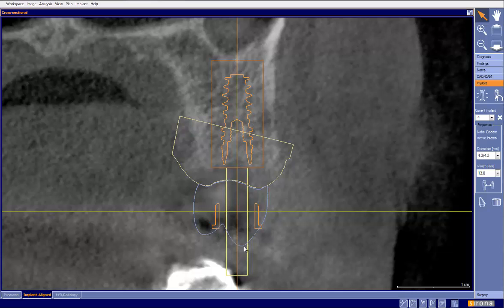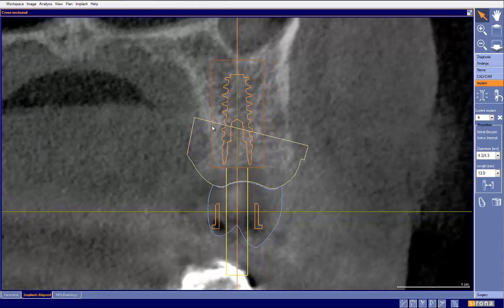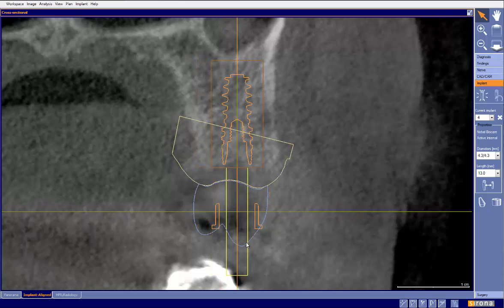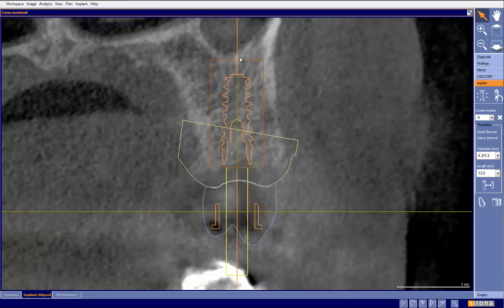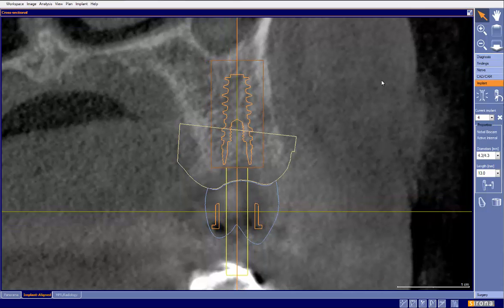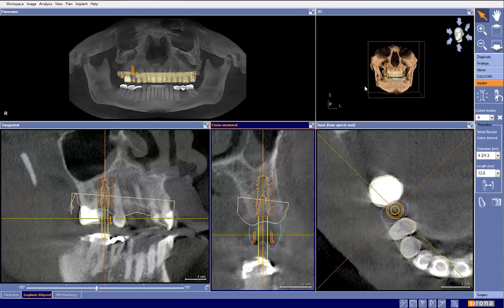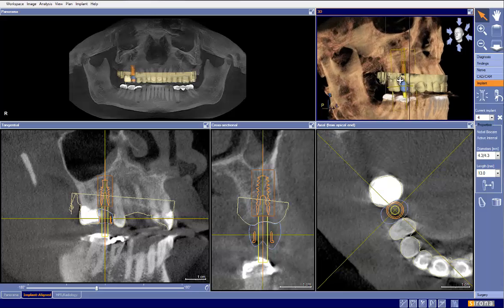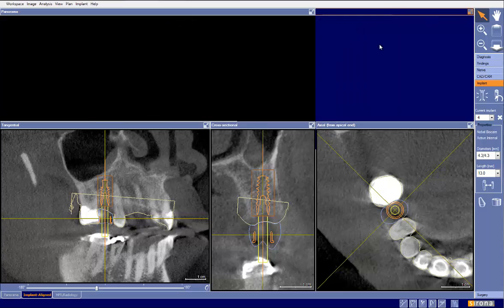So what I'm going to do here is, our options are I can move it, but to move it, I'm going to thin out the bone quite a bit and leave a big gap here on the buccal. So instead, what I'm going to do is go ahead and tilt it some this way and some there. And that's probably a little bit more accurate in terms of how we would like that tooth to emerge from this particular area. So yeah, no problem.